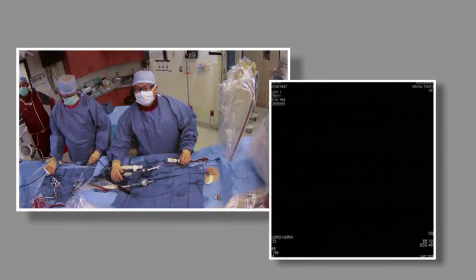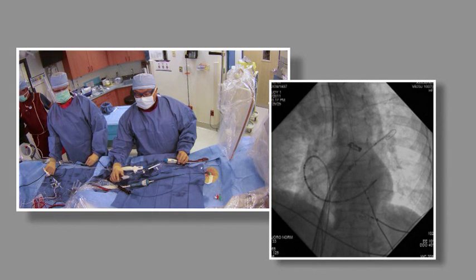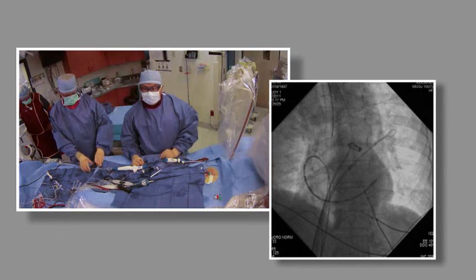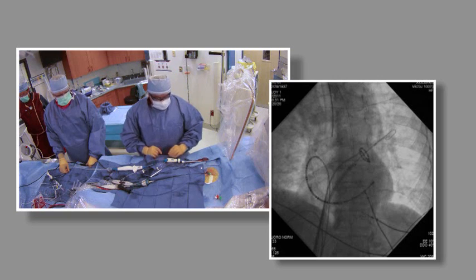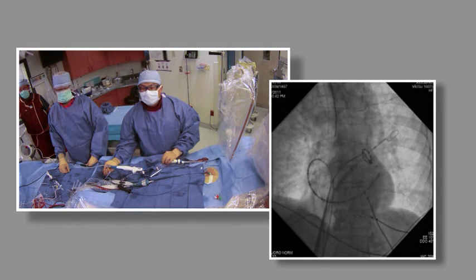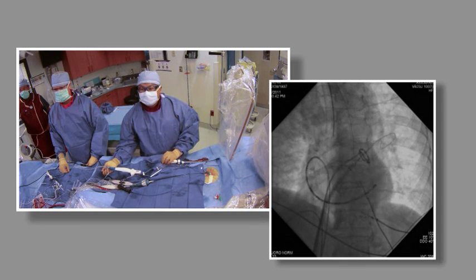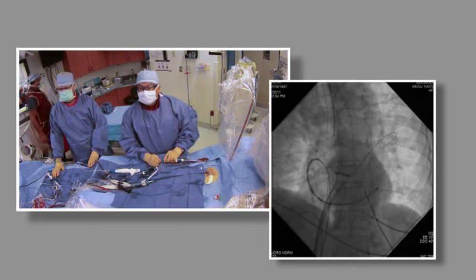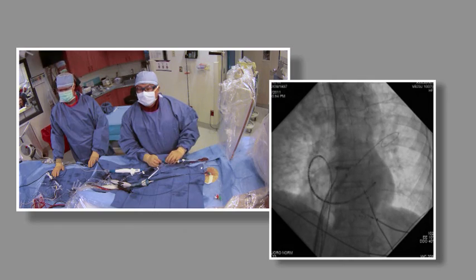Ensure the guide wire is positioned distally into the pulmonary vein before tracking, to minimize risk of perforation. The catheter itself has a couple of fluoroscopic markers. I'm going to pull the spiral back. Using 3D mapping and ICE, I can confirm the spiral is at the ostium and correlate that visually to fluoroscopy — now I know where the ostium is on fluoro. Keeping the wire distally to stabilize the catheter, I pull back the balloon to the first fluoroscopic marker, which is the injection port and main body of the balloon. The second fluoroscopic marker is the proximal end of the balloon, which should be in alignment with the sheath.